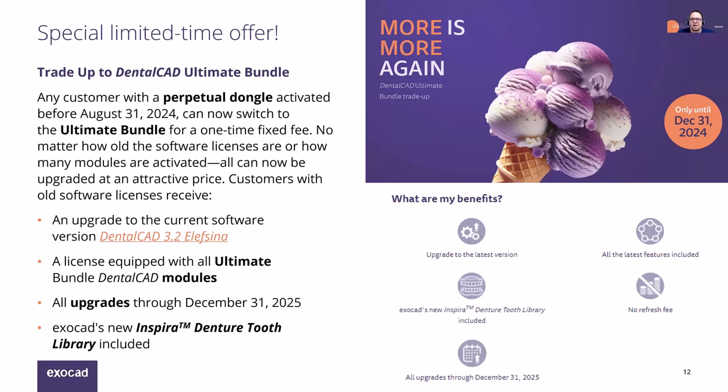Customers with old software licenses will receive an upgrade to the current version of DentalCAD 3.2 Elefsina, a license that will now be equipped with all modules from the Ultimate Bundle, and all upgrades will be valid through December 31st, 2025. So the update contract will be extended for that user for that long of a time. So that's really great offer there.